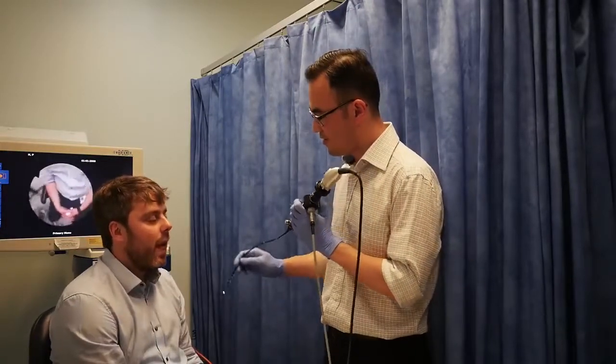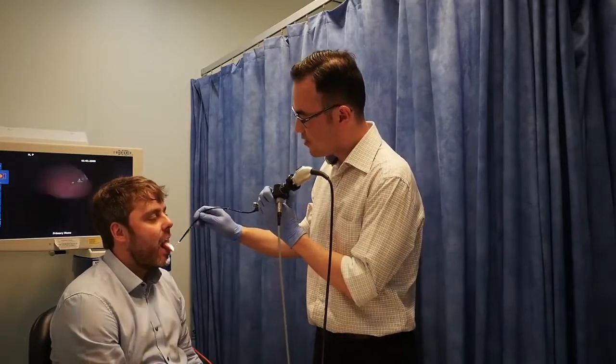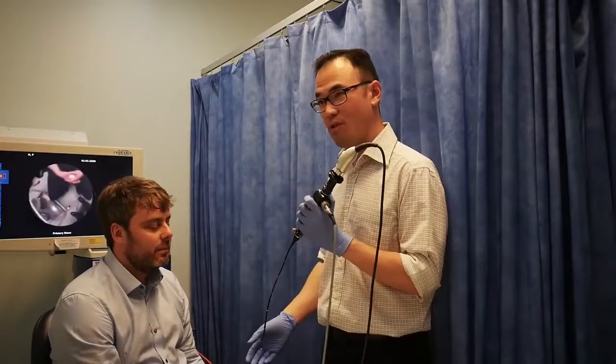Can you stick out your tongue, Phil? Okay, just put a dab of saliva. Okay, tongue back in, all right? And we're ready to go.